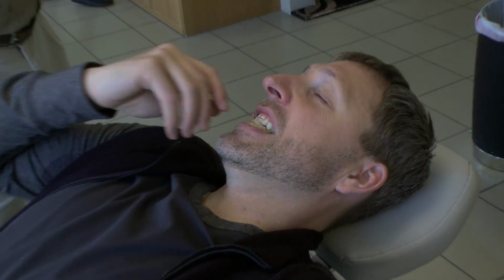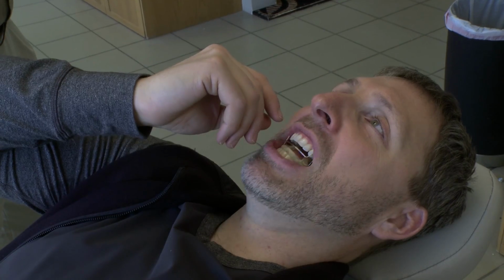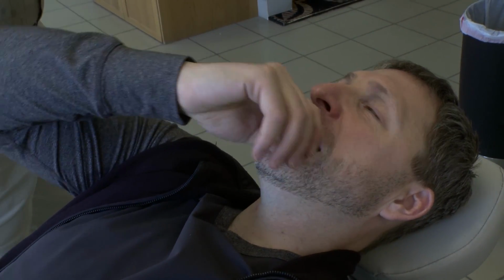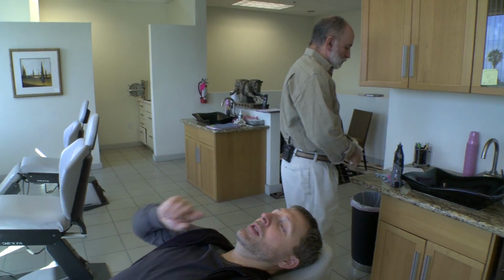It's good. How's that feel? Should feel like you're hitting evenly and simultaneously on the back teeth. Yep. It feels, let's see. Actually, the top right is not hitting. The bottom on both sides is hitting, top left is hitting. So I think the top left needs to come down a bit. Yep. Yeah. Actually, I felt that when I was clenching. I got a twinge in the right.